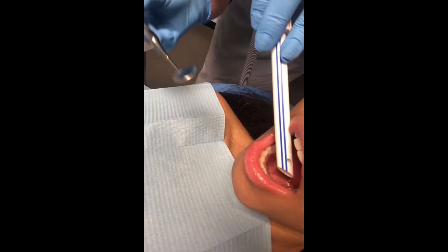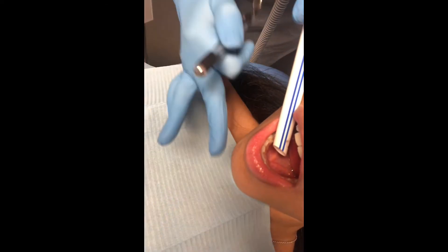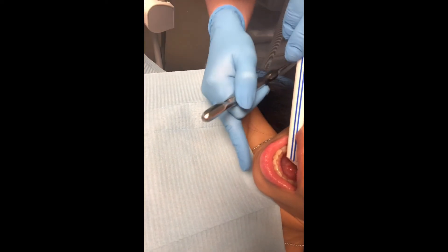You don't need the mirror for this part, but you can go underneath. If you can't see, you can tell the patient: put your chin towards your chest please. That way you can get a better location around the mouth.